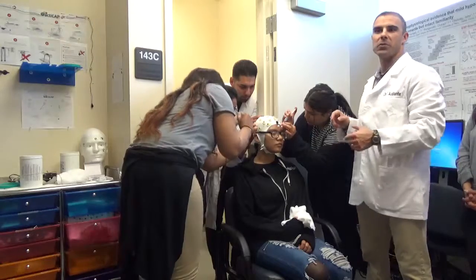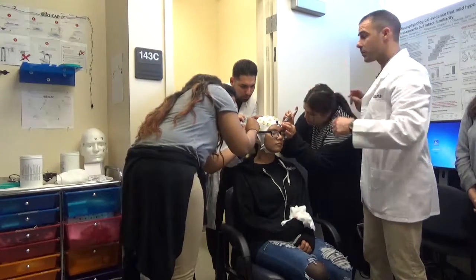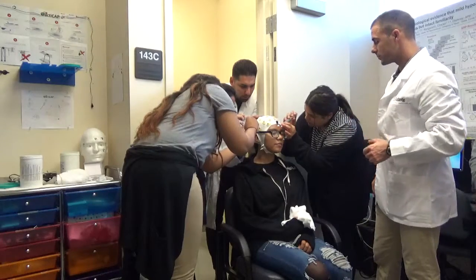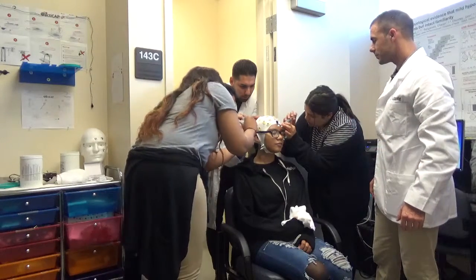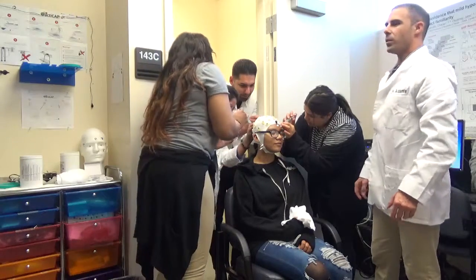So this is why we typically don't have more than, let's say, 4 or 5 people per session, because you can see how crammed it gets. How do you feel in the back? I'm okay. Do you feel it? Barely. Okay. Is this okay because it's in your forehead?